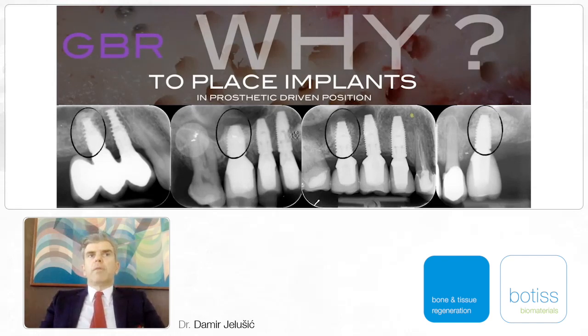We try to place implants where the tooth should be reconstructed, and if there is no bone to place the implant in such a position, we start with GBR procedures to reconstruct the bone, and later on or simultaneously we place implants in the right position.